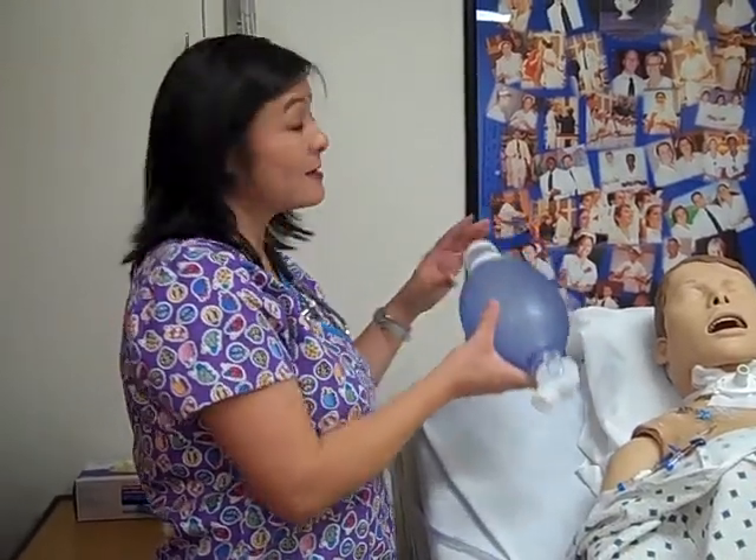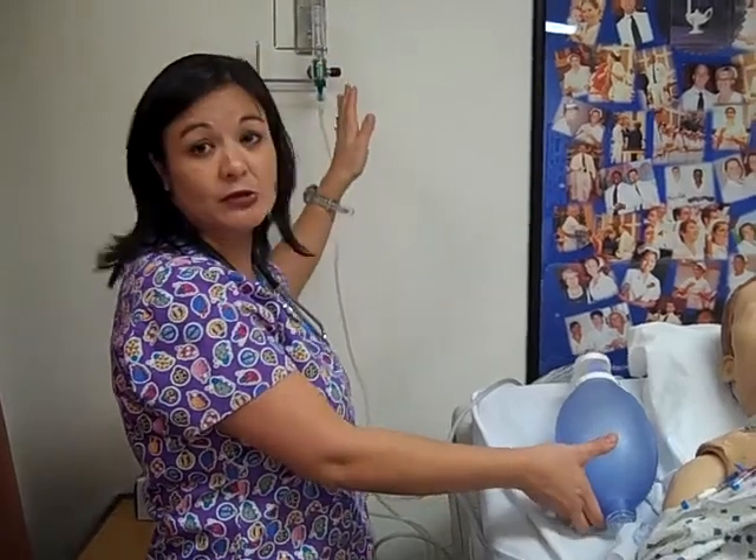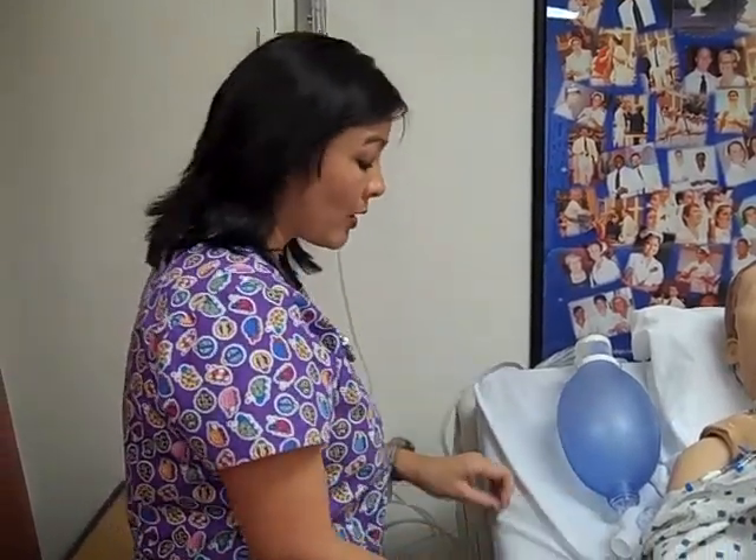Hello everyone. Today I'm going to be demonstrating the skill of suctioning a patient. For this skill you will need a couple of different things. Going through your supplies, you will need an Ambu bag connected to 100% oxygen. Normally we would turn that up to about 10 liters per minute or greater.